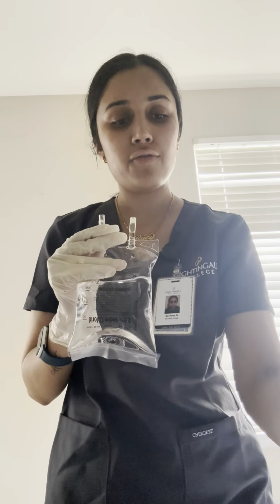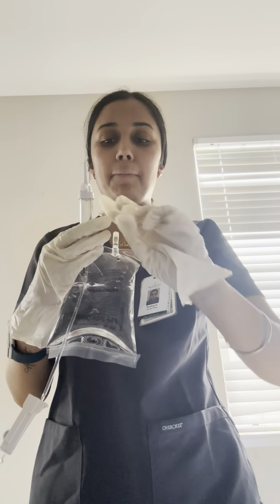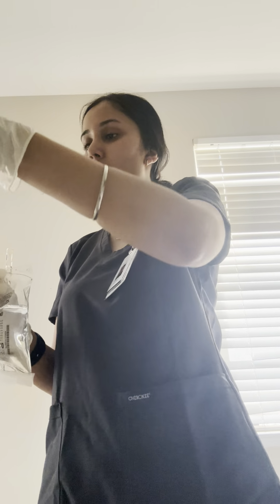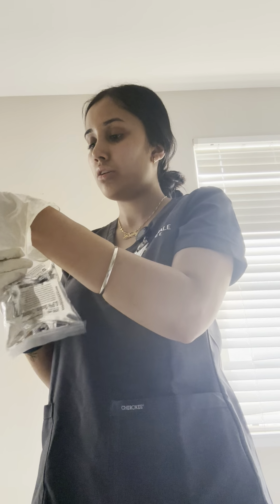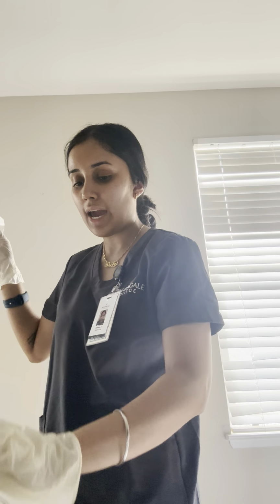So it is off, and then we will grab our primary tubing, take off the transparent cap, and put the spiking into the fluid bag. And you might have to twist and turn a couple of times to make sure that it's secure. And then we would flip it over, and then we will hang this 30 inches above the patient's IV.